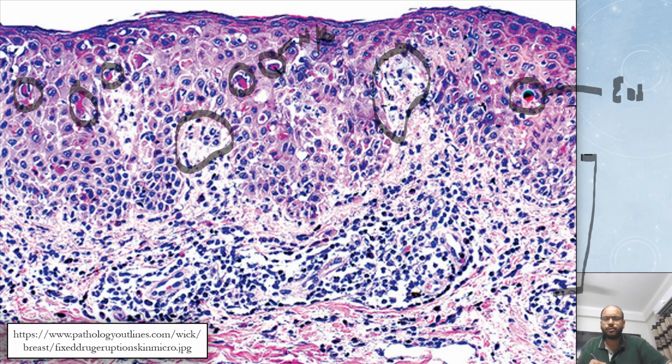You can see the infiltrate is composed mainly of lymphocytes with occasional eosinophils. Look at this, this is an eosinophil. Let me just refresh that. So look at this eosinophil, another eosinophil. You can easily identify them by their red cytoplasm. Can you see this eosinophil-richer infiltrate than the infiltrate we have seen in previous slides? So eosinophils are present in the infiltrate, and you have necrotic keratinocytes at various layers.